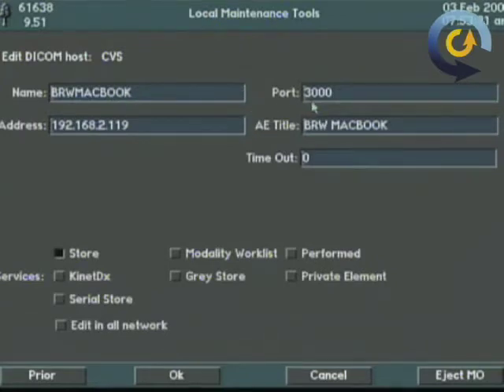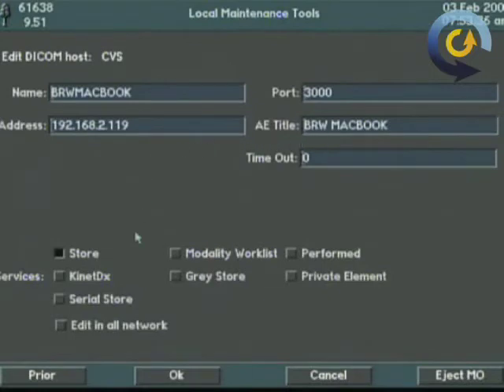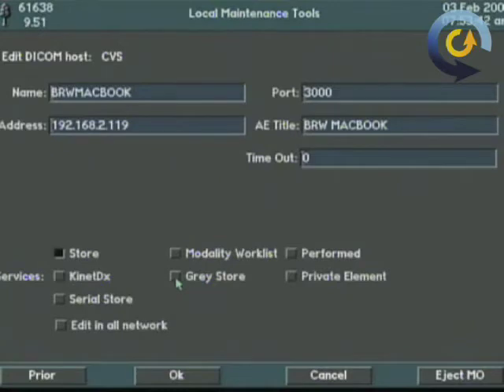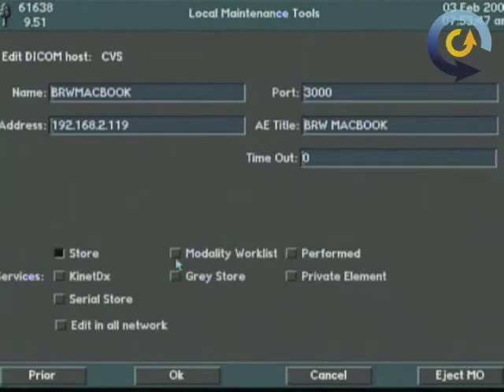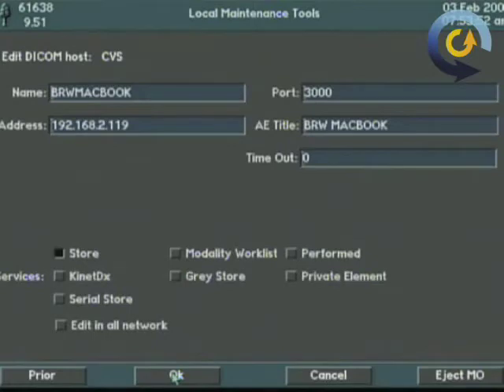The port number, the AE title, and again the IP address is provided by the IT department. I checked store because it's a storage device and grayscale if it was not sending color to save room. We don't need to do that. Modality work list is a different kind of server and we're not going to go over that one today. Hit okay.